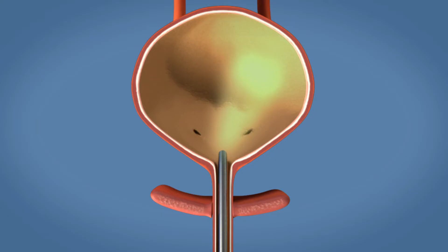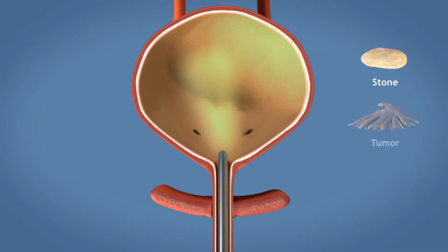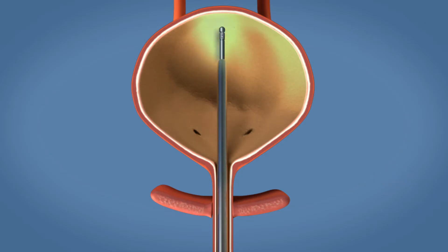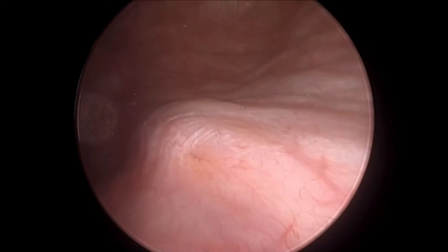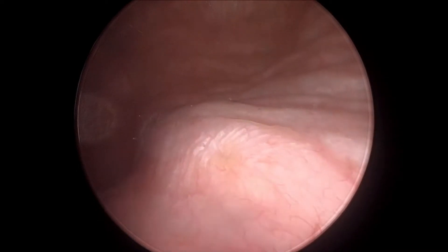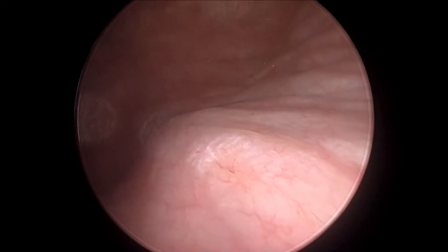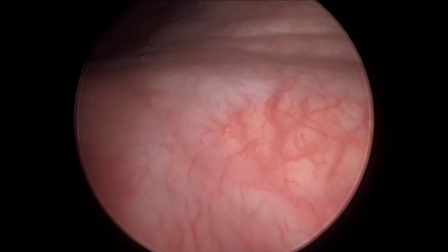After putting the cystoscope, you will introduce it into the urethra. The female urethra is only 4 centimeters, so it will go in easily. Then you should look for any stone, tumor, or scar. After that, you will try to find the trigone of the bladder. If you wait for a couple of minutes, you can see peristalsis and the urine coming out from the ureteric orifice.